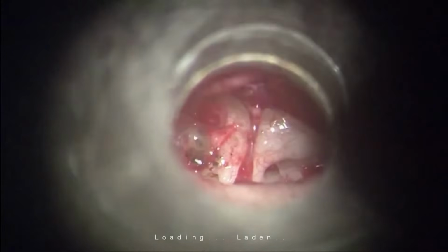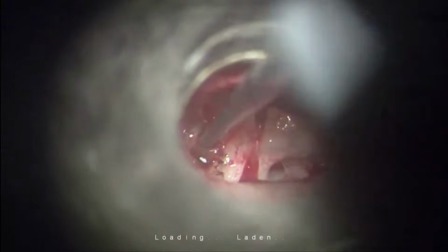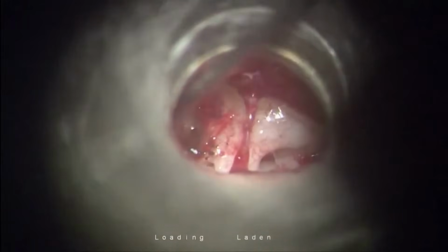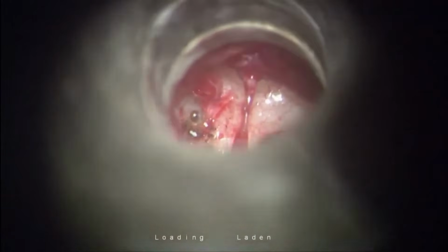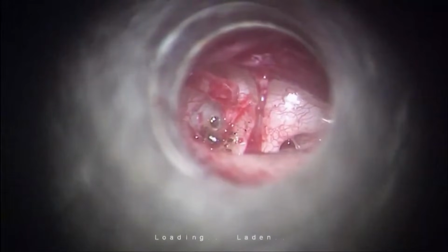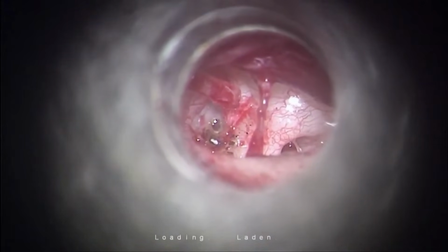Yes. This was a thick footplate which was partially taken care of by the CO2 laser, thinned out, and then I could penetrate easily without mobilizing it. See this fenestra? My fenestra is 0.6 mm, and the piston I am going to use is the simplest of the pistons in terms of simplicity and biocompatibility. This is excellent. This is a clipped titanium piston.